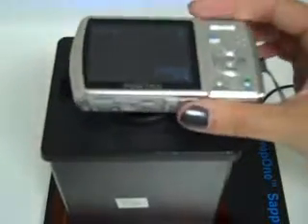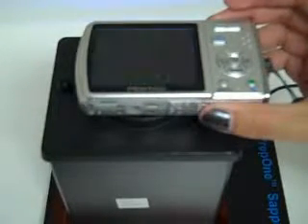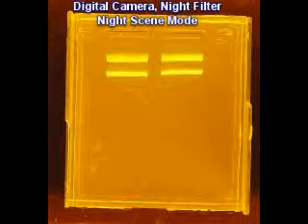Similarly, for a digital camera, aim and snap. For quick pictures, use auto mode. For even more clear pictures, use night scene mode.